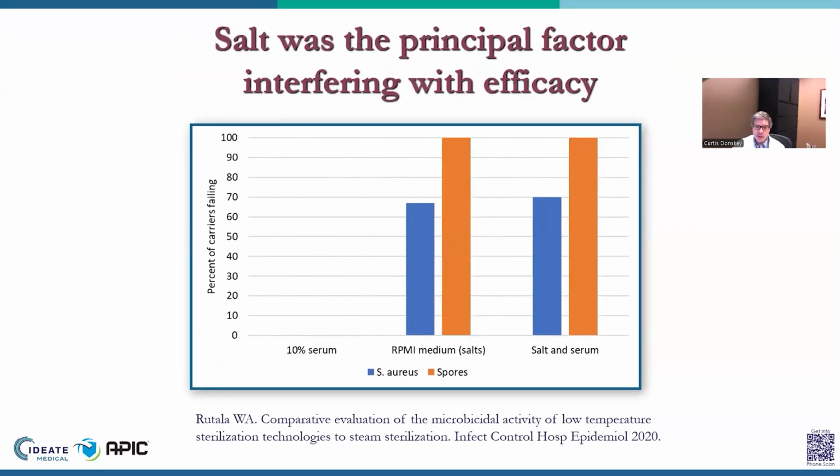And Dr. Rutala did some further investigation and discovered that really it was the salt that appeared to be the principal factor interfering with efficacy, because as you can see, with just 10% serum, there were no failures. That failure often occurred with Staph aureus or with spores when salt was present. Next slide.